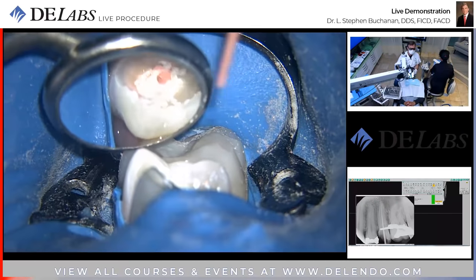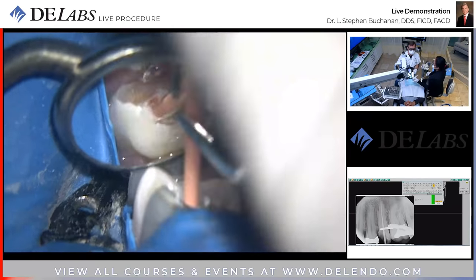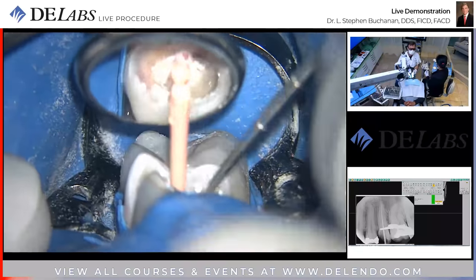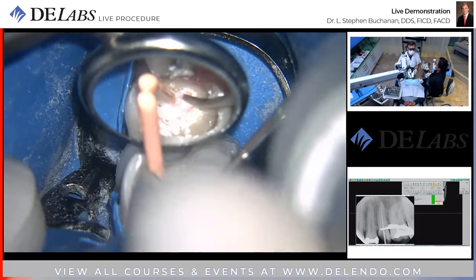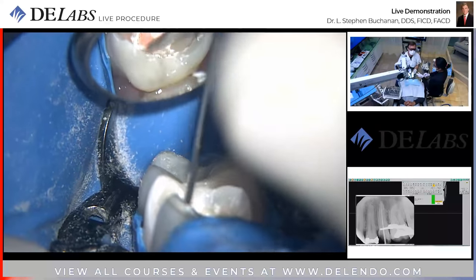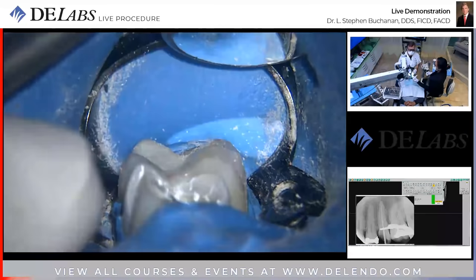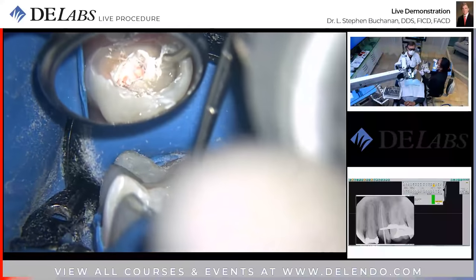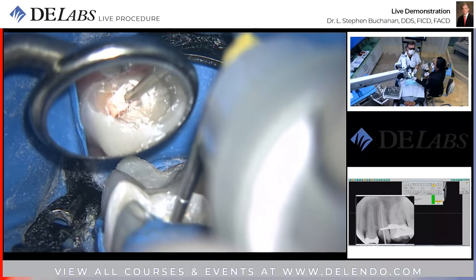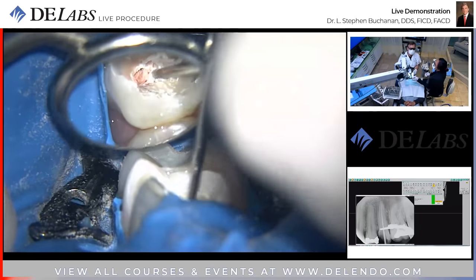Kind of hoping for a little surprise package, you know, you never know. CTs do give you a pre-obturation hint that you might have a lateral accessory canal like we saw at the apex of this tooth. But even though you think you've got it all figured out, you're surprised at how often you'll find one, two, or three more portals of exit than you had any awareness of. Walter Hess was right. I think he was chronically depressed, but nope, he didn't make that stuff up. Root canals are complicated. The coolest thing about the specialty right now is we now have the tools to manage it in all of its complexity, and that is going to relate to a win.